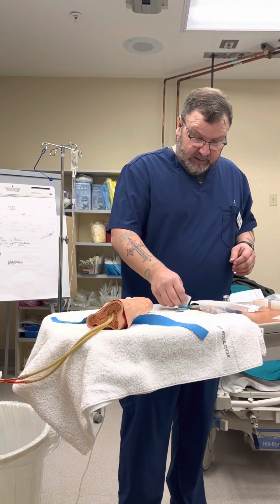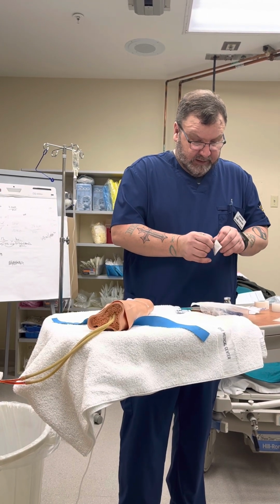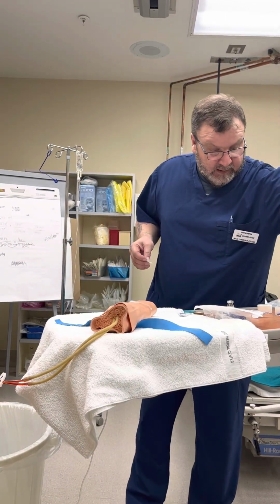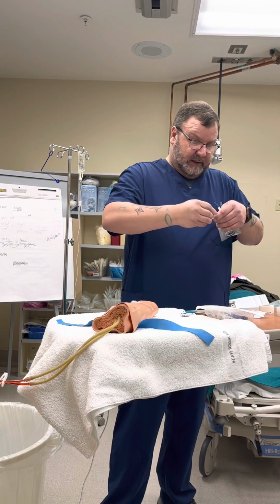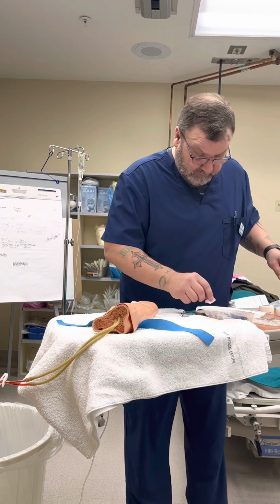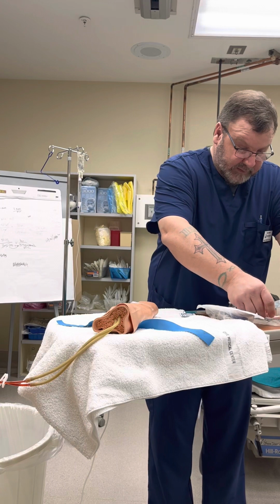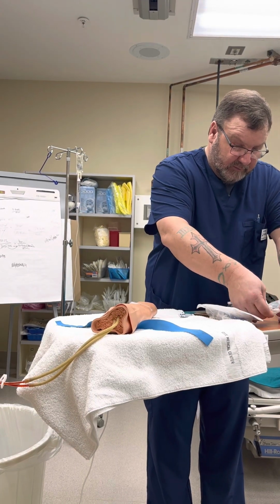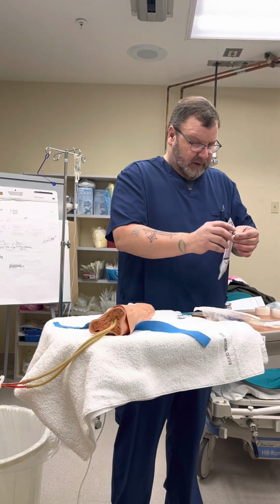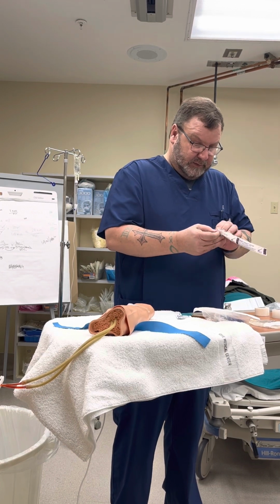So that being said, I would prepare my supplies. I've already done some hand hygiene. So I'm going to take an alcohol swab and clean the medication port on the medication. I would also take a red label. I don't have a red label, but you have to pretend this is red. I'll label that with the pertinent information that goes on it, according to the MAR: date, time, dosage, my initials.